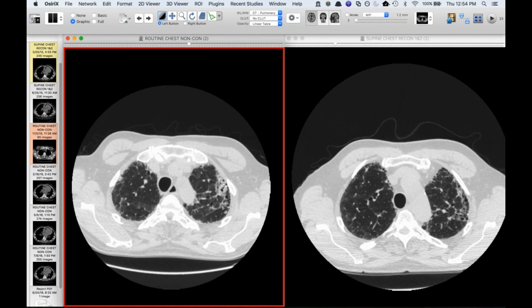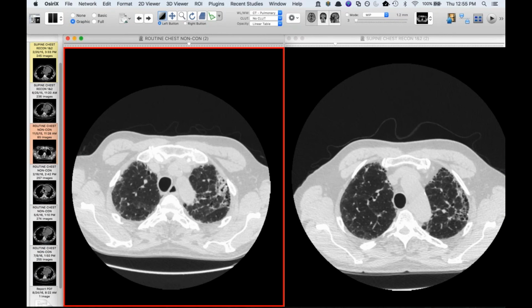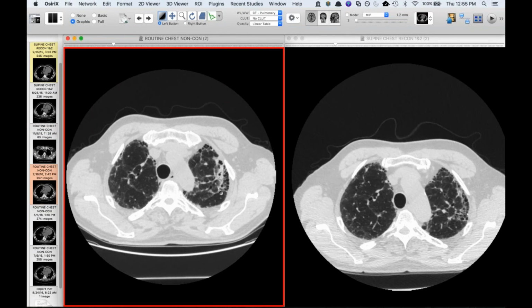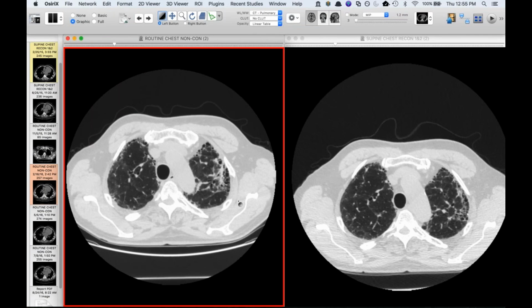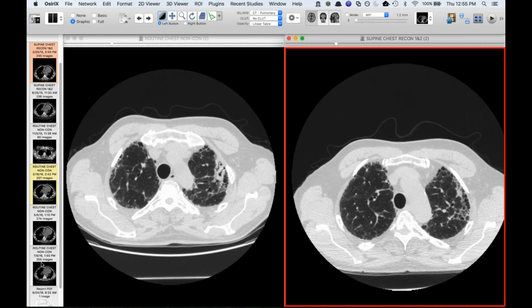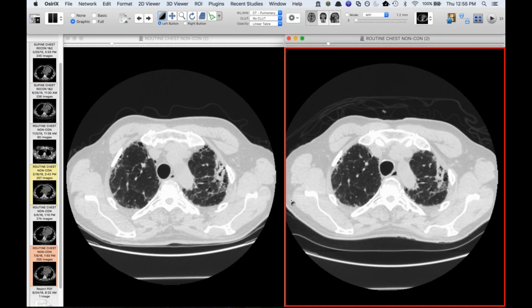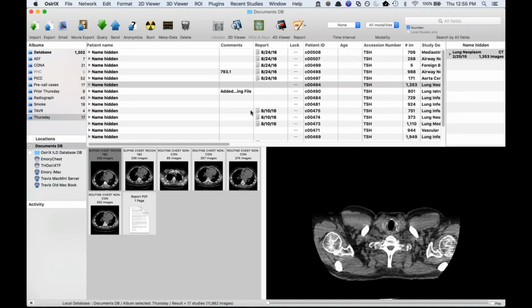Yeah, on this one, I was worried it was cancer, or that it could be, or it was a focus of infection or something, and then it stabilized or slightly got better, and then I actually read the follow-up and said, I think it's stabilized. It's probably just some focal fibrosis. Especially because it didn't change, or at least even looked like it slightly regressed. Travis, the traction bronchiectasis in the lesion seemed to get worse as it seemed to collapse down, which would support it being fibrosis. That's why, as my colleague Brett here says, never bet against cancer, but this one we had bet against cancer. Oh right, this one is just bizarre.